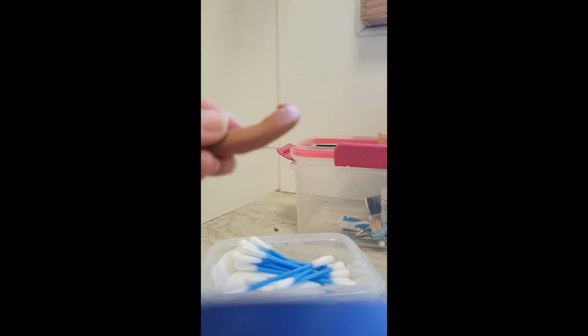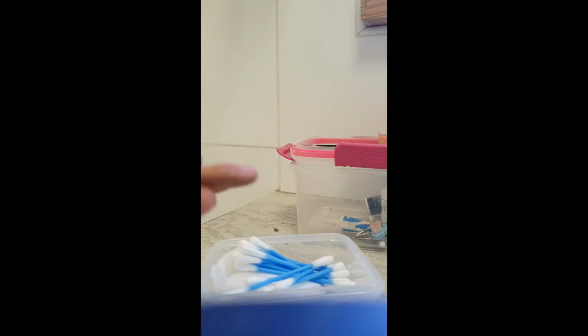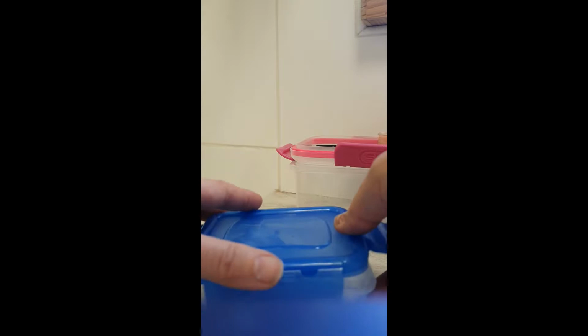But you can see in the container there are two ears. This ear was originally made, but the color was a bit dark. The colors get mixed individually for each person, and this one is a bit red. My ear was actually very red that day. So we then based the color on my other ear, and it is this ear, and it is also the ear that I'm going to put on today. So I need this, and I need an earbud, so we can put the other ear away. We can close up. I've been told to just always close everything up to make sure everything's always protected.